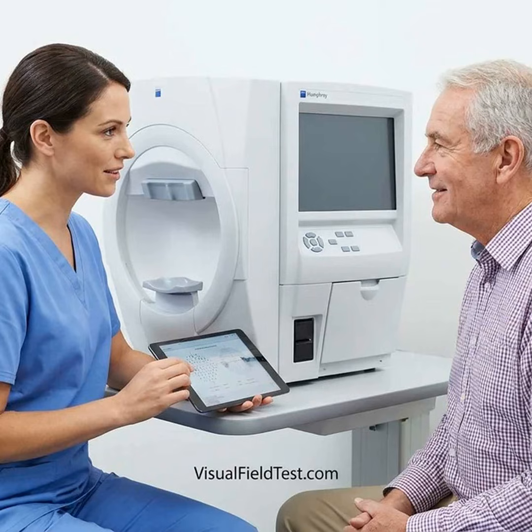In a 12-month study using the Melbourne Rapid Fields home application, weekly testing compliance was 75% when weekly text reminders were used. However, only about 65% of home tests met the study's reliability criteria, compared with 85% of supervised in-clinic Humphrey Field Analyzer tests. The first 9 home tests showed a learning phase, after which the correlation with in-clinic results improved.